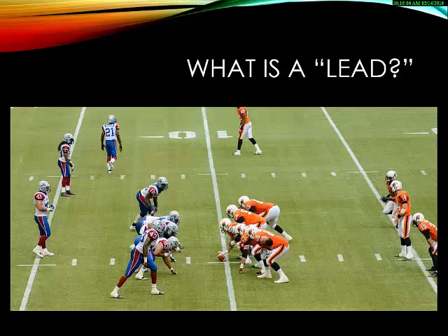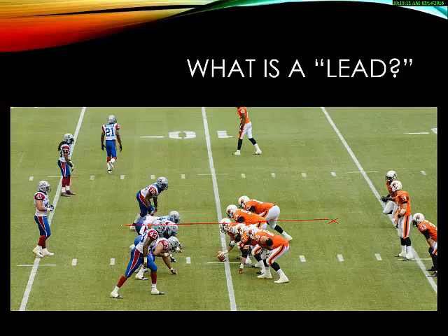All right, so let's think about this as a football play. The quarterback hands the ball off to our running back here, and the running back runs a running play up through the middle and into the secondary. It's just one play. All right, this is one play that we're looking at. However, in the case of various leads, we're looking at this play from different angles. So if you are in the stands somewhere up in this area, over here, all right, we're going to call you the positive electrode on your lead.